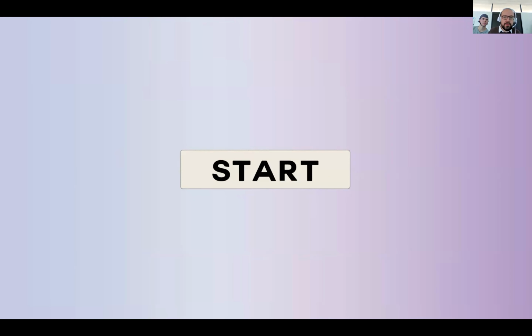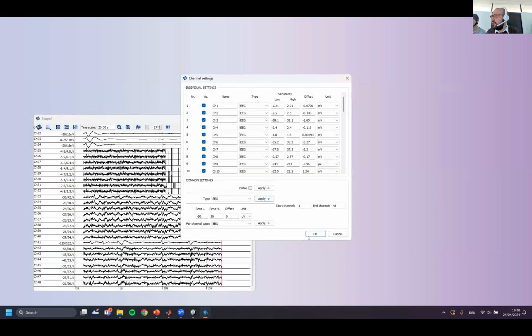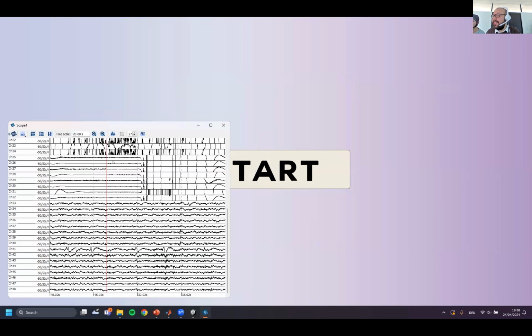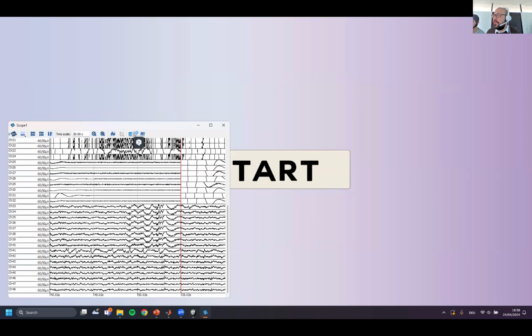We'll have a bit of noise. So you can see the data acquisition happening in real time for all the users, with different locations. We had one user moving a lot, it was Vaishali. When she moved, you would not be able to see much of the channels. So we can have a look separately.